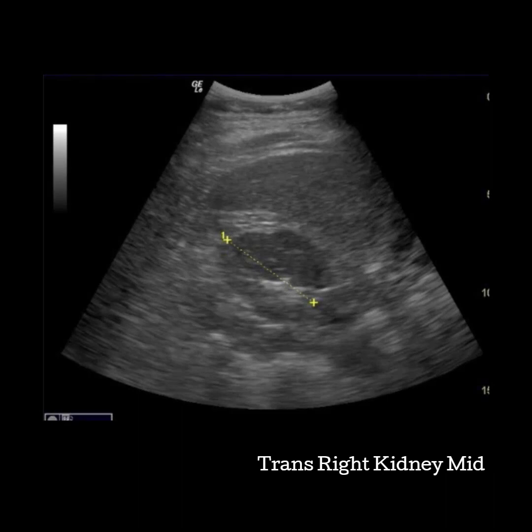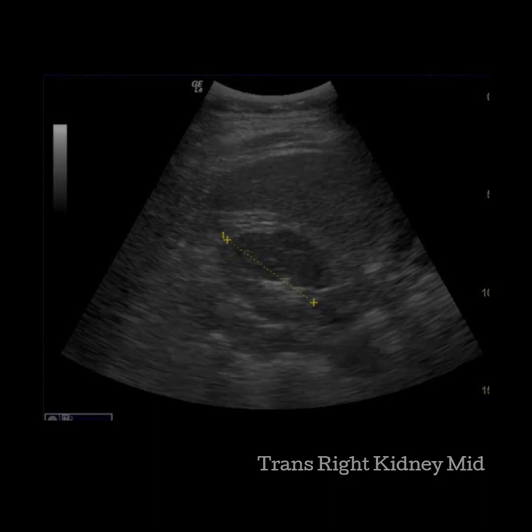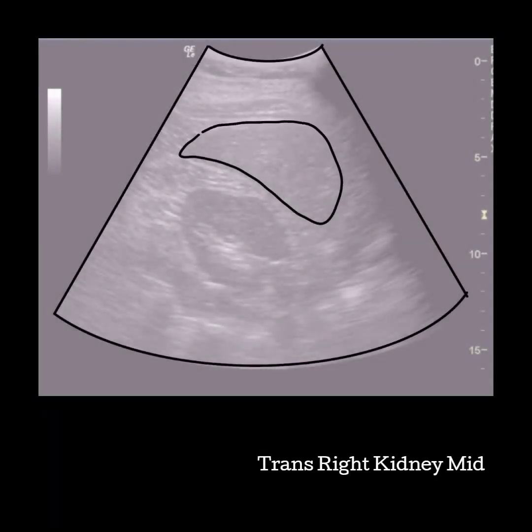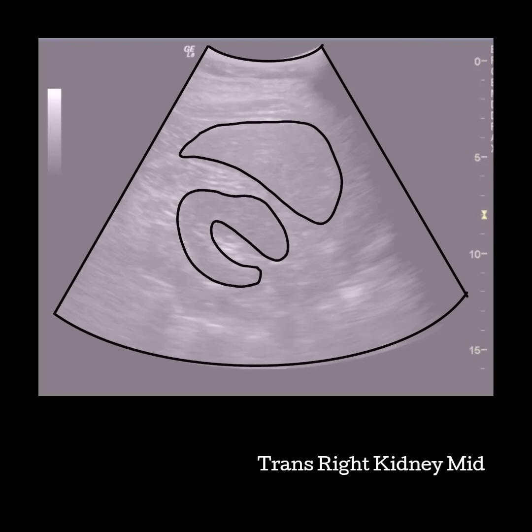You will measure the kidney in transverse. Place your first caliper in the middle of the C to close the loop. Drag the second caliper across the kidney to cut the kidney in half. There should be an even amount of kidney on either side. The kidney looks like a C when you are in the mid transverse plane.